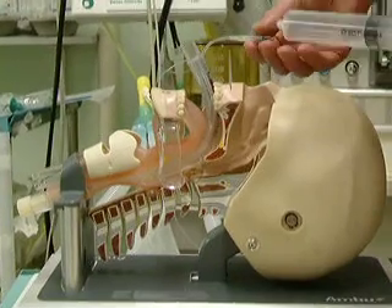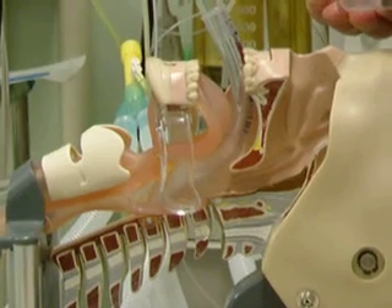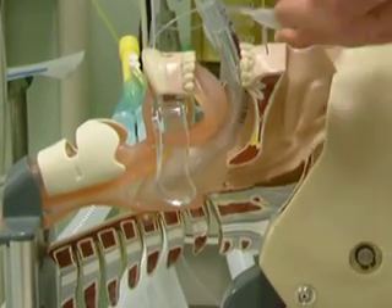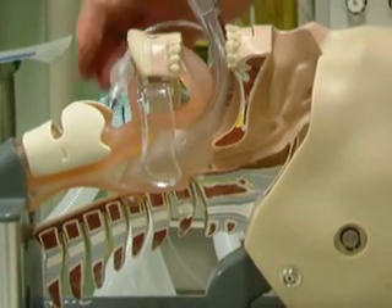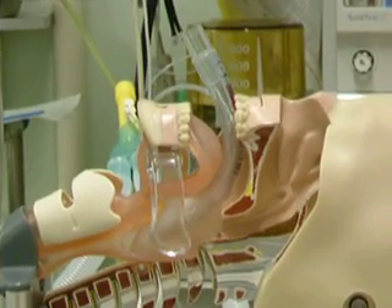You feel it go past the tongue. I am going to insert it — it is a deflated airway — with 45 mils of air, and you can see that it brings the jaw forward and it sits over the laryngeal inlet.